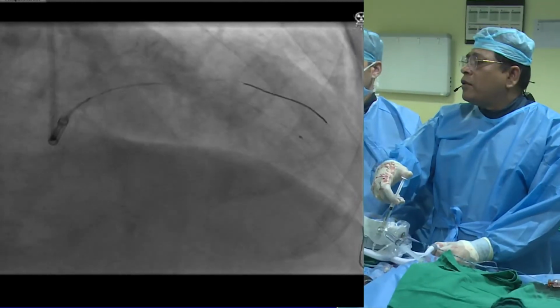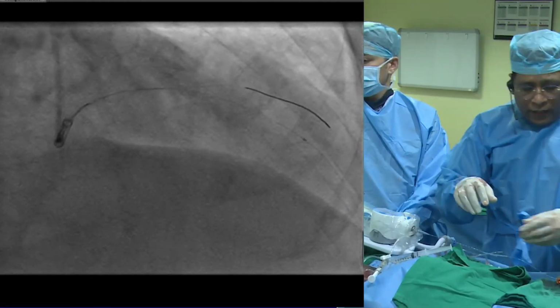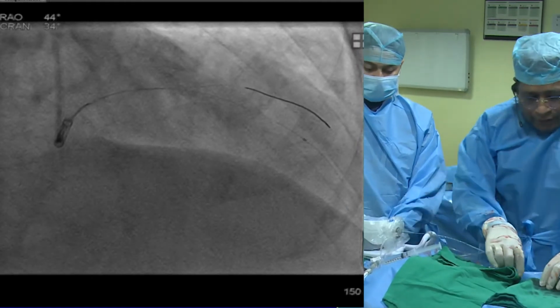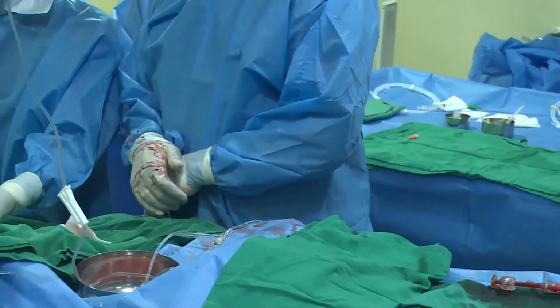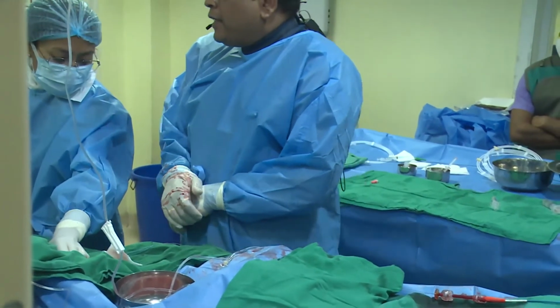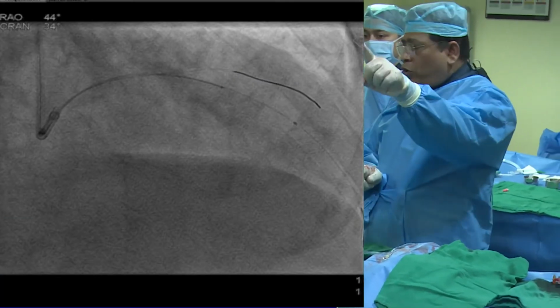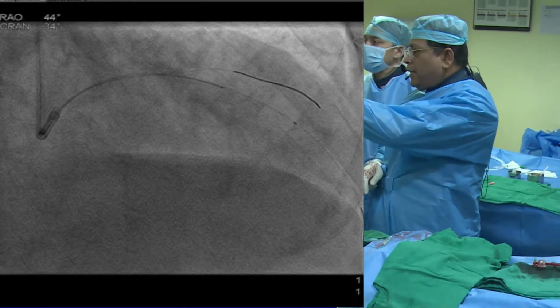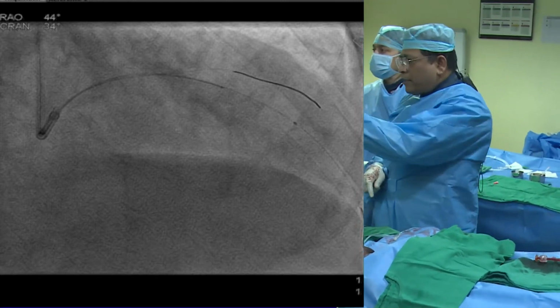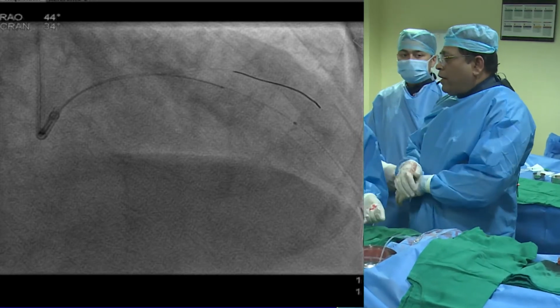Okay. So left main is also a little diseased, and now we will take it out. So the vessel is around 2.5 maximum distally, and can you measure the length? The cine which we have acquired is the proximal segment. So if we measure the length properly from IVUS, and we deploy at the cine image where we have kept it, it will be doing our job.